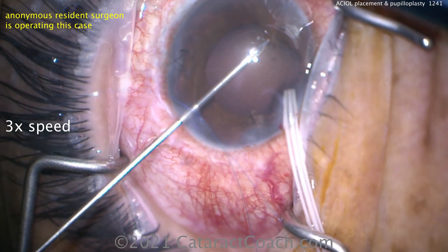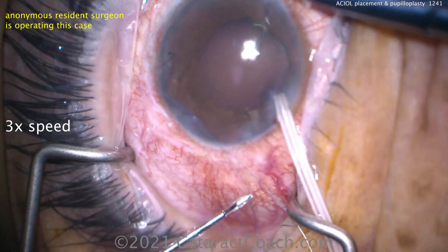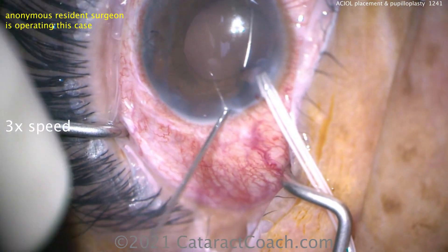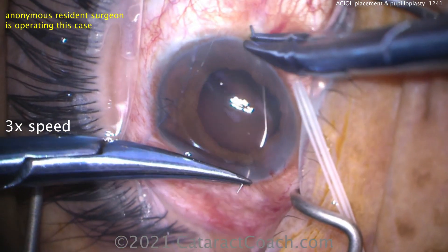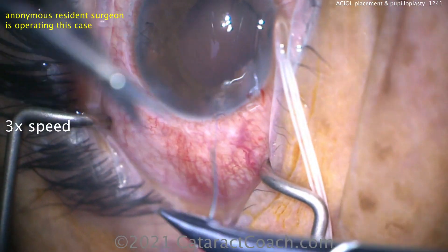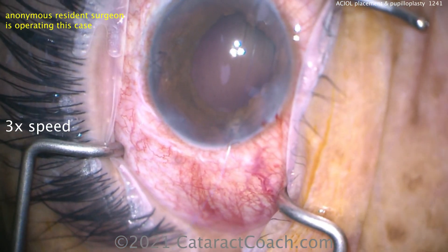This time using forceps — 23-gauge micro-forceps in the left hand, suture going in the right. That's a 10-0 proline on the long needle to get a nicer, chunkier, bigger bite of the iris tissue. We can now dock it through the hollow bore 27-gauge needle and pull it outside the eye. Again, I'll show you the 4-1-1 — Agarwal's forethrow pupilloplasty.